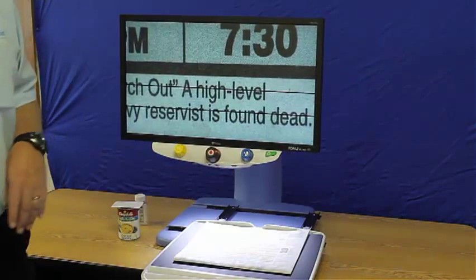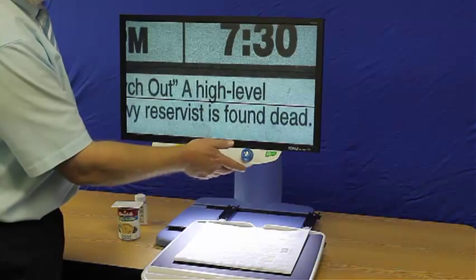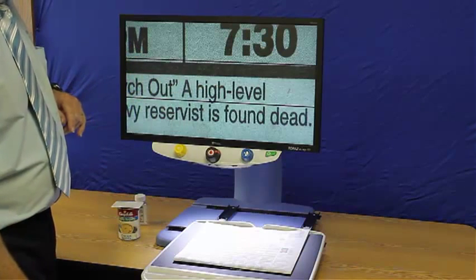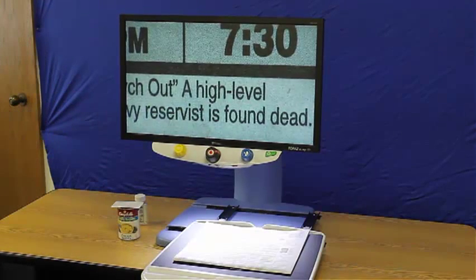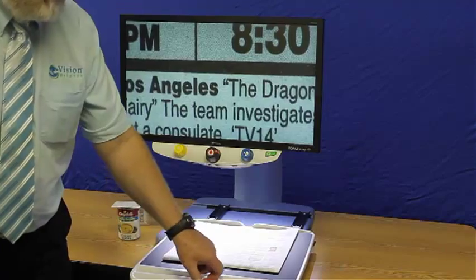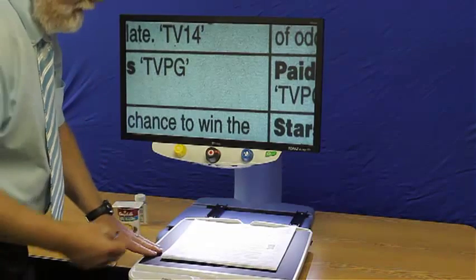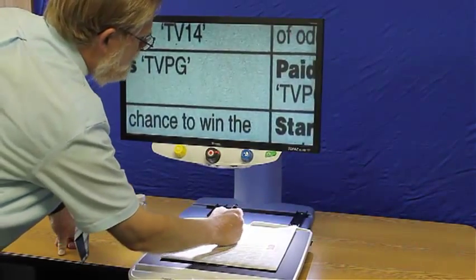We can also have lines. Put 2 lines, again, move them where you want, put them how far apart you want. So you could actually have 2 lines showing, to help you follow along that way. Push it again, we're back to normal. The red bar on the table here is used when we want to write. If we want to write something there, we can lock it into place. The table doesn't move. Now we can see where we're going to write, and we can actually write there.